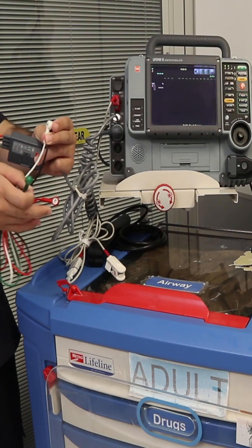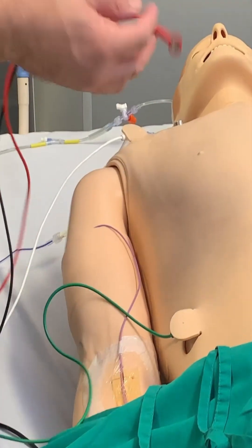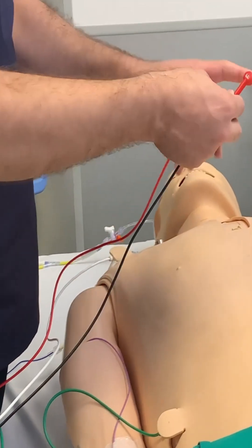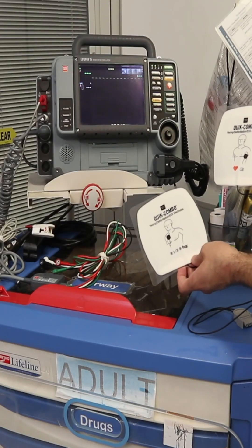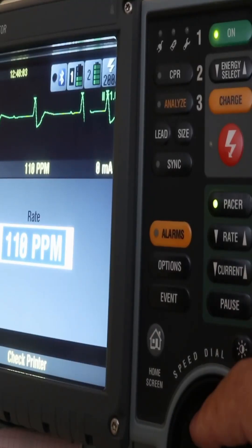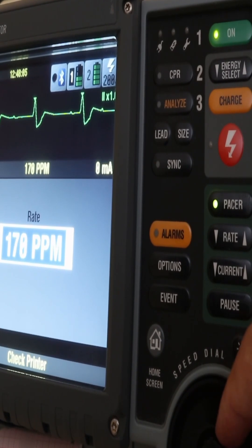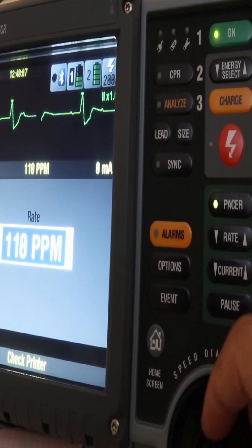If your patient is conscious, explain the procedure because they will have some discomfort, and the physician might prescribe analgesia. We have to apply the ECG leads beside the pads, because the pads are only used to deliver the pacing stimulus, not to read the ECG. Then apply the pads.